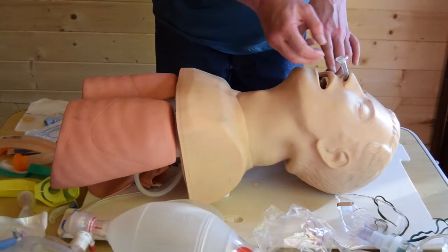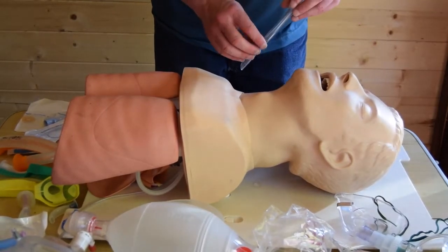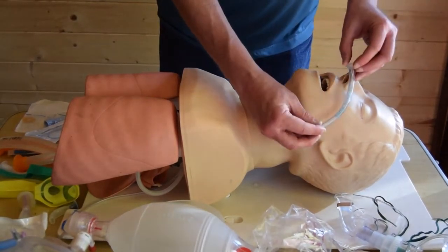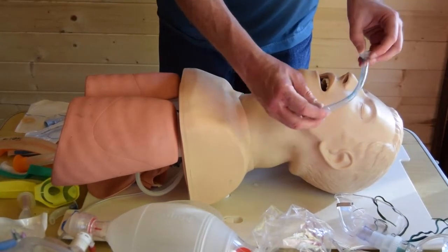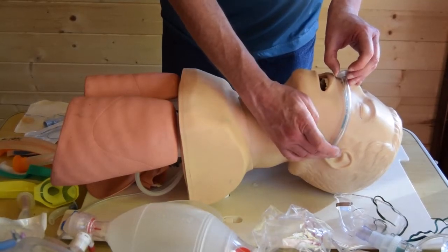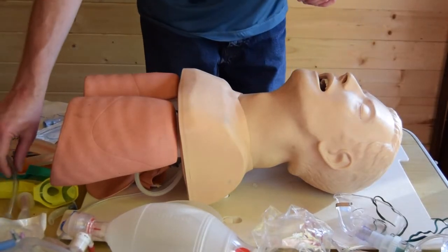If I was going to measure this airway, if I just take this out a second, again we think about the exterior anatomy compared to the interior anatomy, and we have the opening and we have the back of the throat. So we laid one against the other, and you can see that this one will more than fit this patient. Actually, what we need to do is measure it from the nares to the tragus of the ear. So this one is actually a little bit long, but you can see for illustration purposes. So that's two sorts of airway.